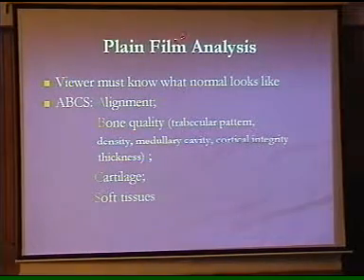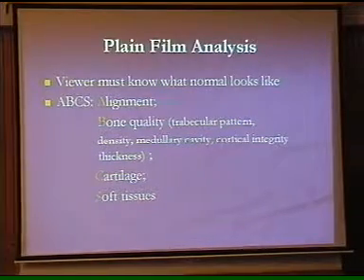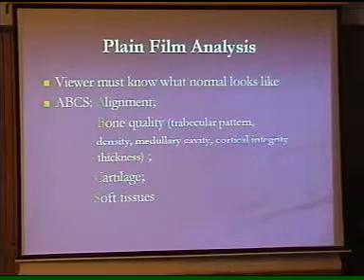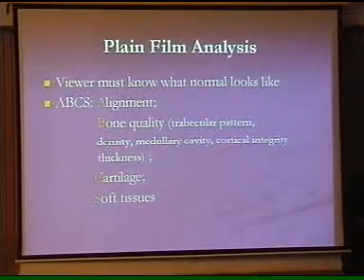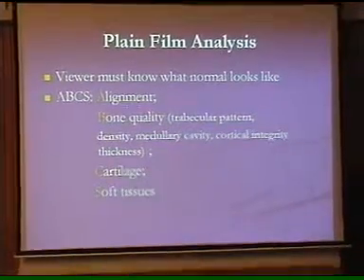Regarding the bones, please let me assure you, the plain X-ray of the area of interest is still very, very important, irrespective of the modalities which I am going to show you later on. Especially plain X-ray of high KV, that means a penetrative view, is very important when you're suspecting some tumors or any small subtle change in the soft tissues which may not be visualized under a non-penetrative view. So the best is to do the high kilovolt or high penetrative views. That's the best way when you're looking at any bone.